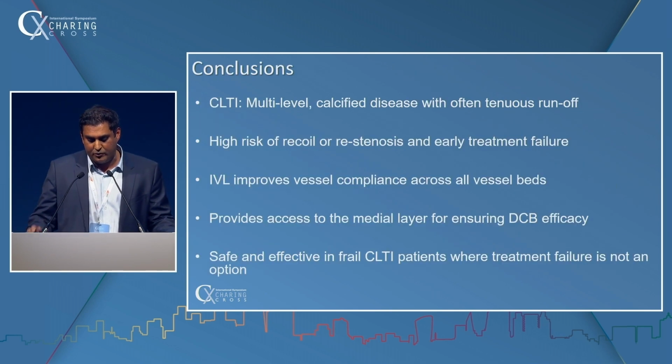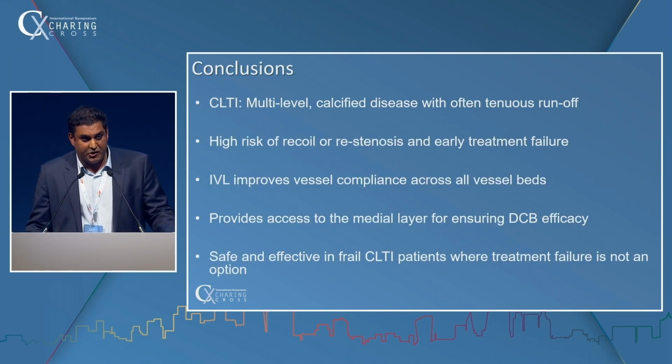Again, our patient cohort. So to conclude, IVL is a good tool for multi-level disease, often with patients who have very poor runoff. We know these patients have a high risk of early recoil, on-table, or restenosis, and we have to use a treatment modality to prevent this.